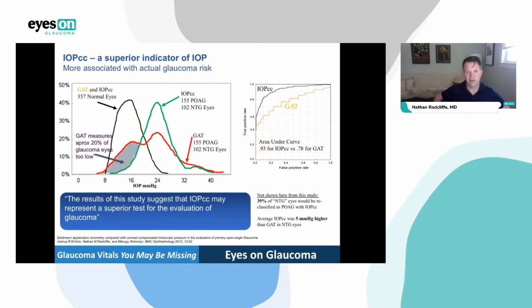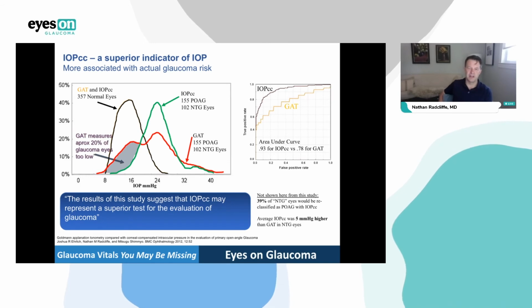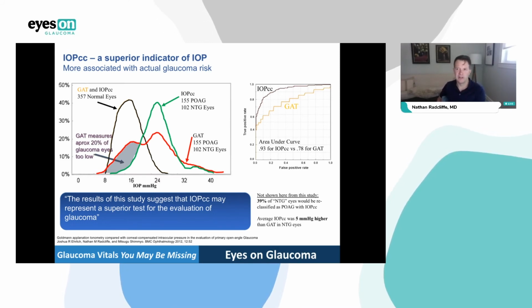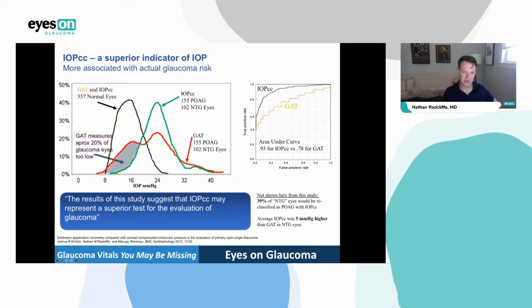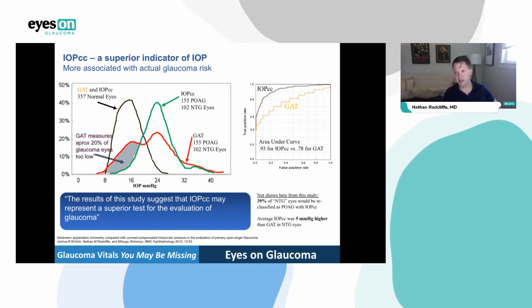This is kind of a complicated graph, but in theory, you could use intraocular pressure to diagnose glaucoma. Now, what do I mean by that? Well, if you could really get an accurate sense, I think you'd find that in general, patients with glaucoma do have higher pressures, and those without it have lower pressures. The problem is that with corneal thickness and hysteresis messing with all of these numbers, you end up with this red graph. The red graph is the pressure distribution of patients diagnosed in a clinic with glaucoma. You see there are some very high pressures, but there are also many, many low pressures, people coming in with a pressure of 16 who have glaucoma. So Goldmann applanation tonometry can't be helpful in diagnosing glaucoma.